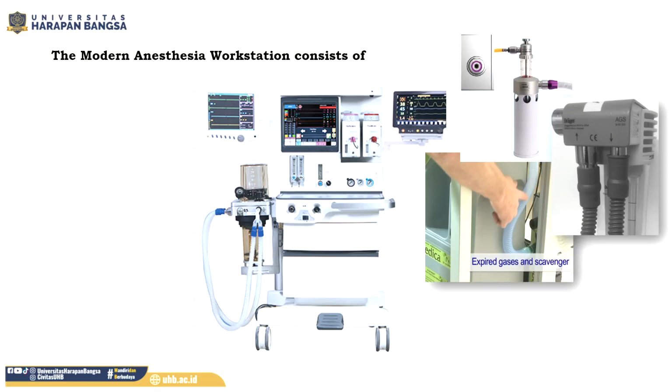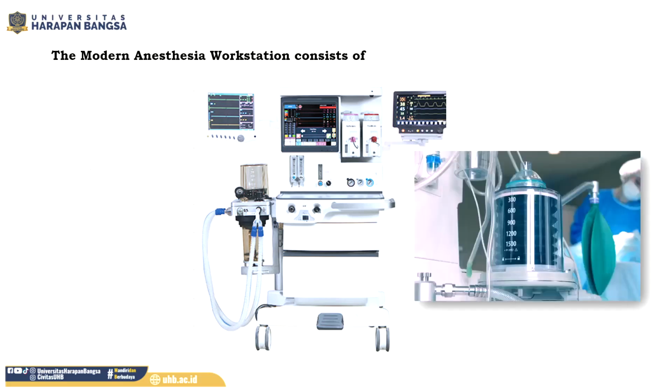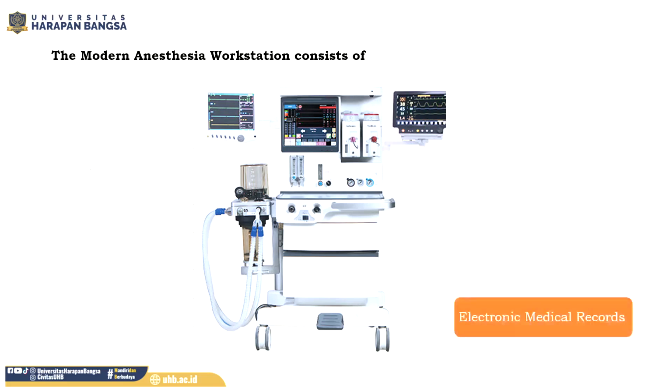The anesthesia workstation also has advanced ventilation, and it also has an anesthesia and patient monitoring system, and electronic medical records.